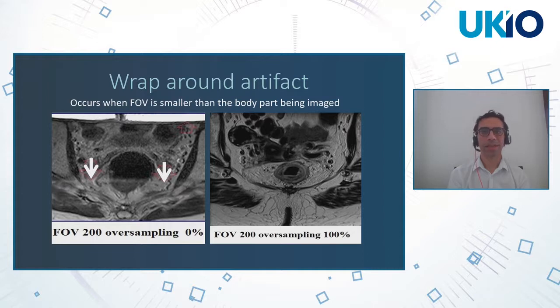To briefly explain aliasing, the continuous MRI signal is picked up by the receiver coil and converted into its digital counterpart for presentation as the image. This involves sampling the continuous signal at defined intervals. The sampling rate should be at least twice the highest frequency within the signal. At lower sampling rates, higher frequency signals become indistinguishable from lower frequency signals, i.e. they become aliases.